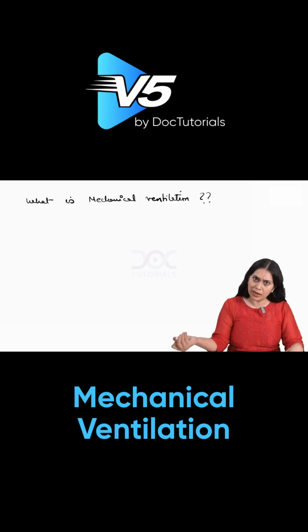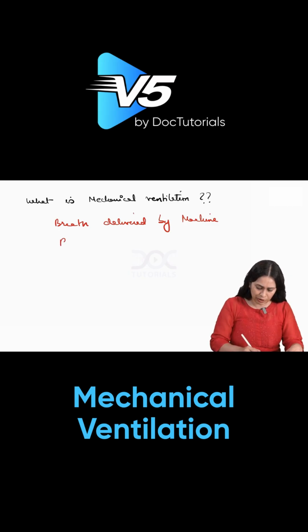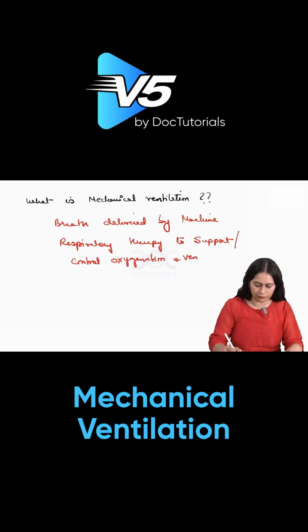So I told you what is mechanical ventilation. It is breath delivered by machine, that is the ventilator. So it's a respiratory therapy to support the oxygenation and ventilation. To support, control oxygenation and ventilation, got it? So this is what is mechanical ventilation.